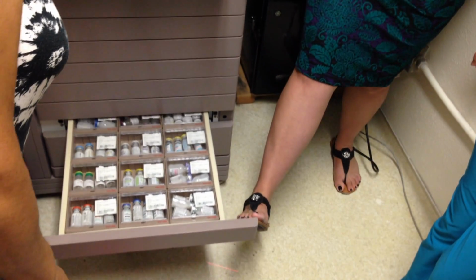Okay, the appropriate drawer is going to pop open, and all of these are really long, so I'm going to have you step back just a tad bit. All of them are really long, but the drawer opens and the cube opens.